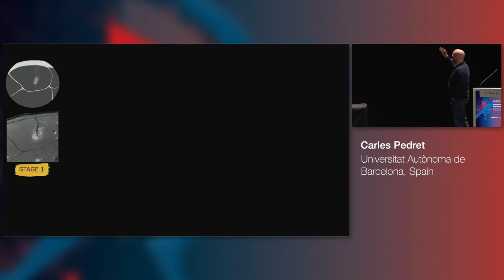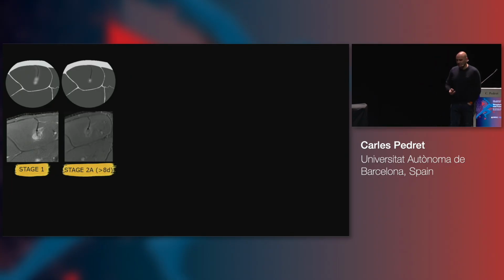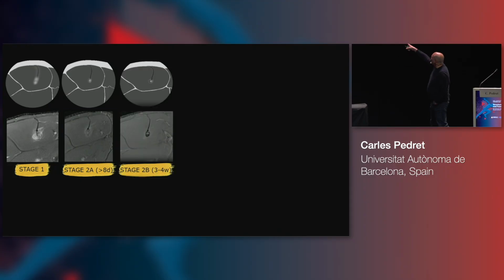So this is an acute injury. This is the rectus femoris central tendon, okay? We have this acute injury. This is the stage we call 2A, which is around 2 weeks, between 10 days to 2 weeks, okay? You can see that we start doing something in terms of hypertrophic reaction in the scar, okay? But in the center, it's still very weak and soft.